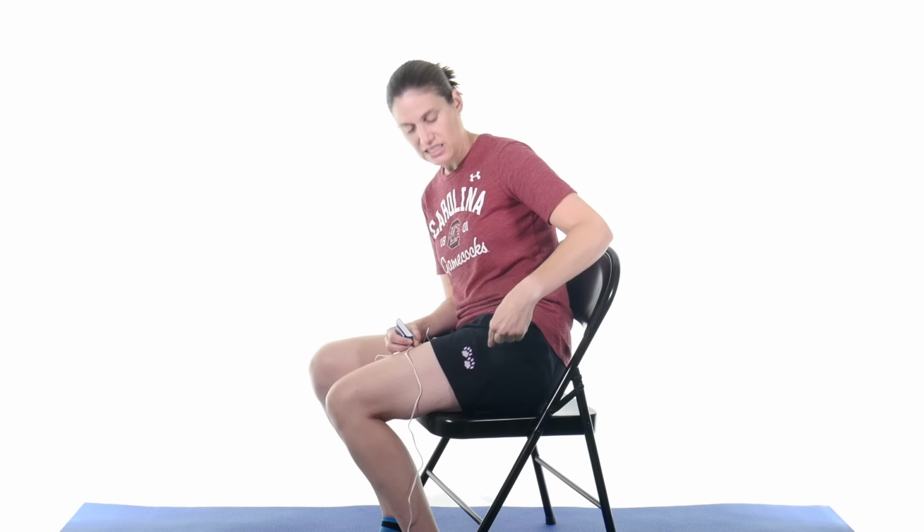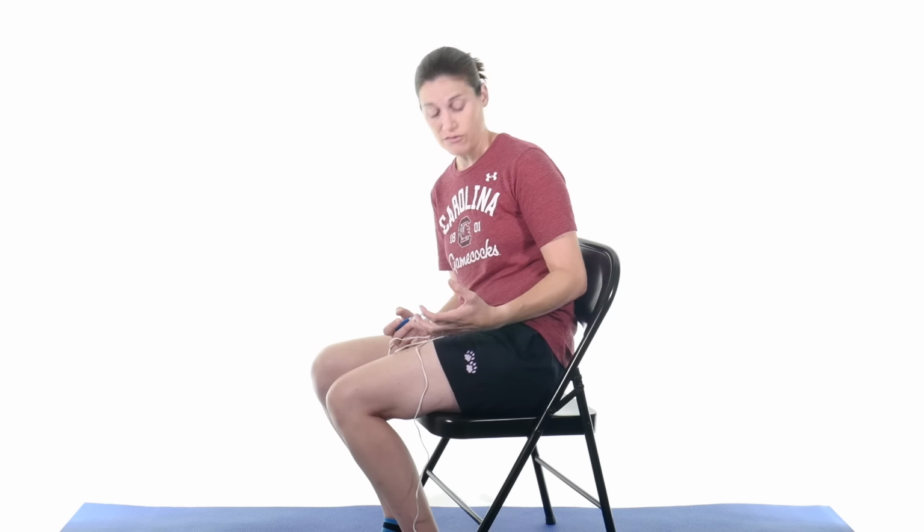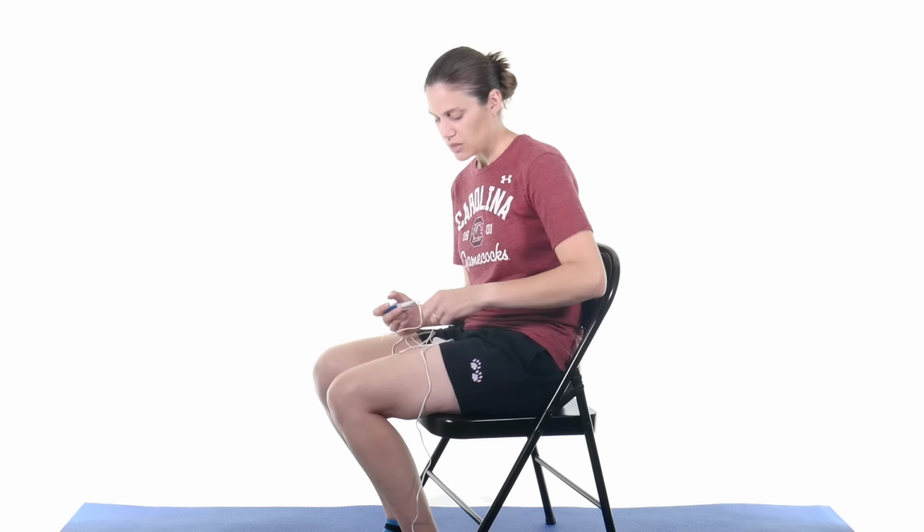If you wanted to get more of a specific spot, so maybe you're saying it's just right here, it's not really the whole area, this spot is one that hurts, then you can just do the one channel, which is 2 electrodes, and just put one here and one here, or you can do it side to side, whichever one is more comfortable for you. Then you're getting it in the specific spots, because the closer the electrodes are, the stronger it's going to be. It's kind of the same if you have 4 electrodes around, it's a general strongness, but if you have 2 close together, it's going to be a lot stronger. So that's how you can do it if you want the 2 electrodes or the 4 electrodes. But the biggest thing to remember is to make sure and cross it.